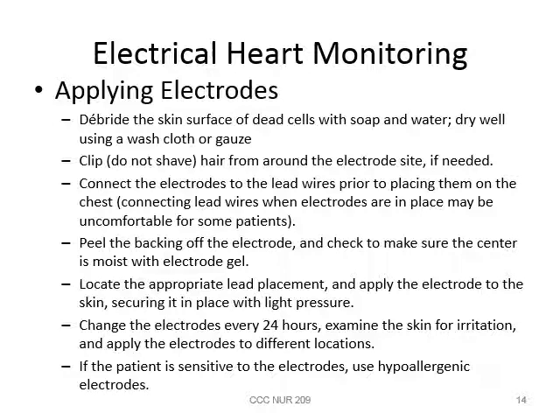Connect the electrodes to the lead wires prior to placing them on the chest. With the old push-on buttons, if you put the electrodes on first and then tried to connect the leads to the electrodes, it was very uncomfortable for patients because you had to push very hard to get those on. So always attach the electrodes to the leads prior to putting them on the patient.